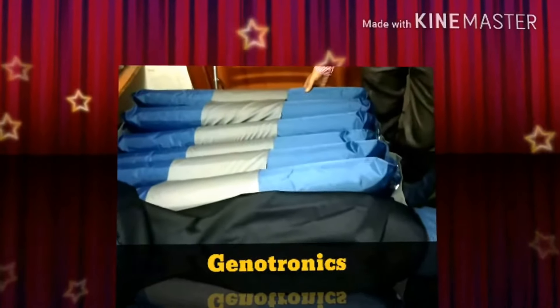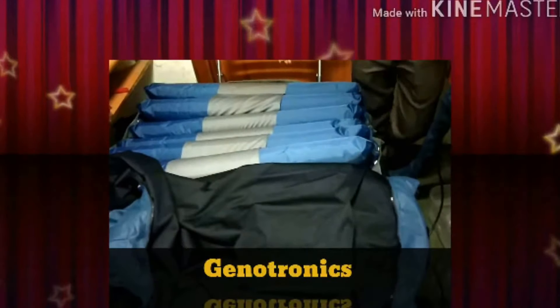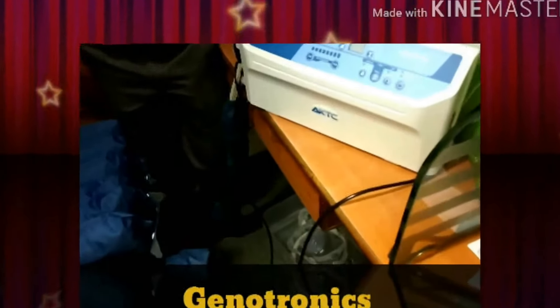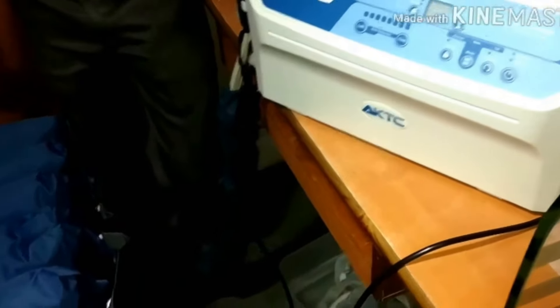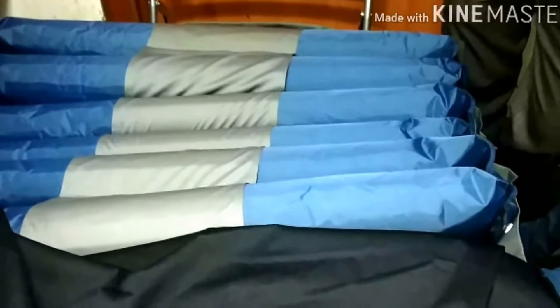Today we are introducing a high end air mattress named AKTC Optimal Dual Air Mattress. This air mattress is comparable with the leading brand in the market.